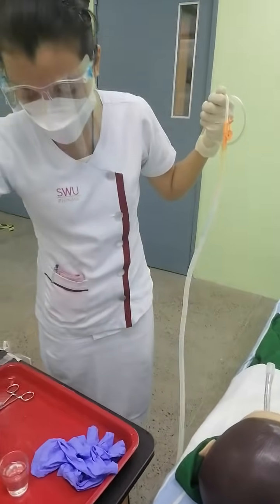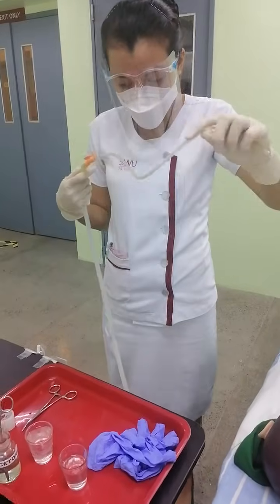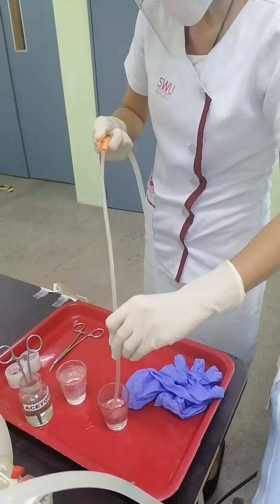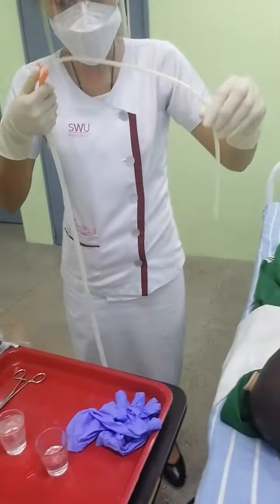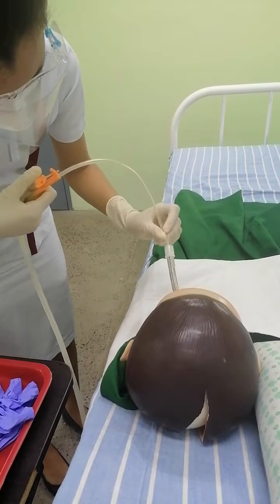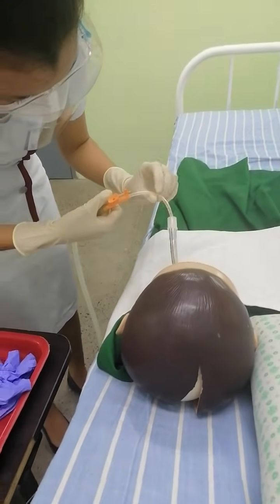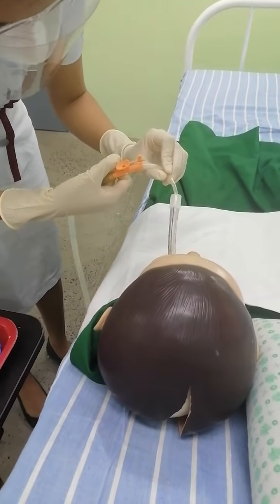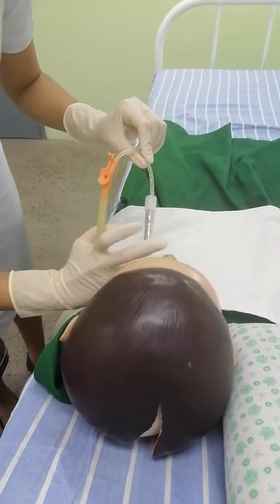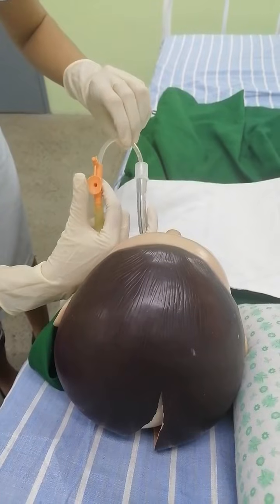If necessary, I will do the same procedure again — cleaning the tube with normal saline solution, then inserting it gently without applying suction pressure. Once there is resistance, I will retract one centimeter and then perform circular motion with intermittent suction. It is important to stabilize the tube throughout the procedure.